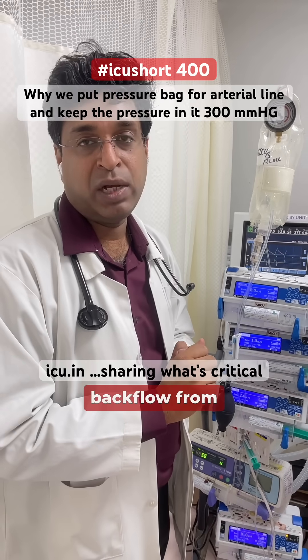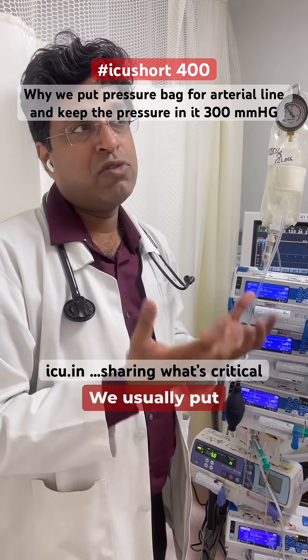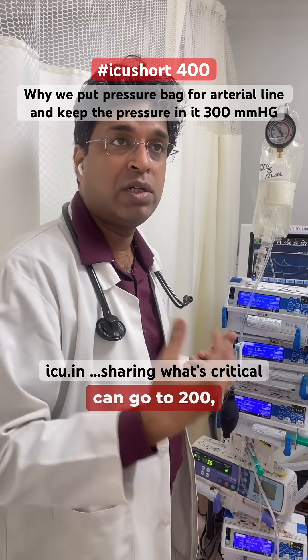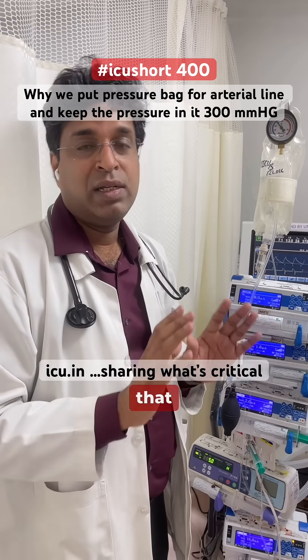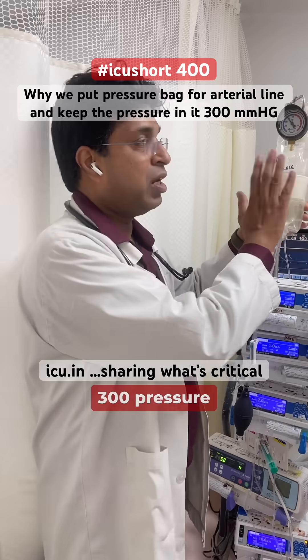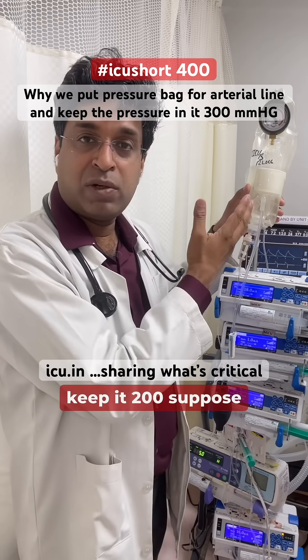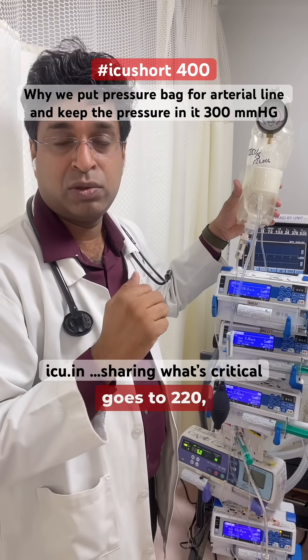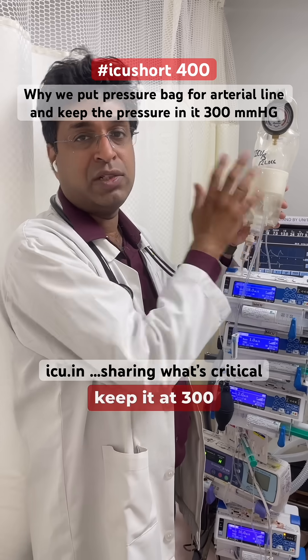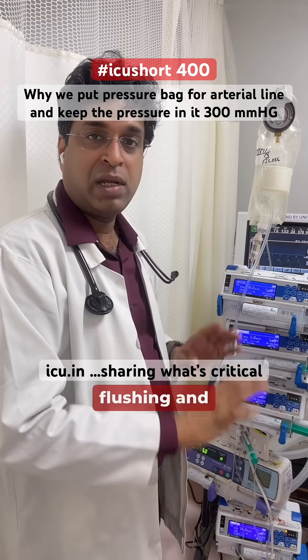Why is 300 mmHg specifically required? We usually place arterial lines in patients with hypotension or hypertension, and blood pressure can go up to 200, 220, or even 240. We assume it will not exceed 300 in any patient. So even if the pressure is 240, the 300 mmHg counter pressure will overcome it. If we only used 200, and the patient's blood pressure rose to 220 or 240, it would not be sufficient. That's why 300 ensures the line stays flushed and the transducer remains clean.